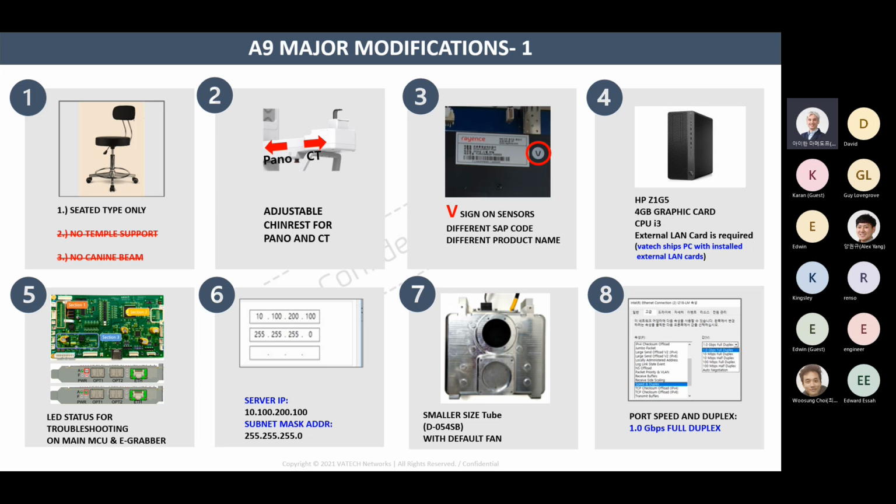So we have LEDs on the main MCU for you to understand the status. Every LED has an explanation, which is in the appendix in the technical manual, so you can refer to them. Whenever you go to the site, by checking these LEDs, you can know where the problem is. Every LED has its own code and explanation.